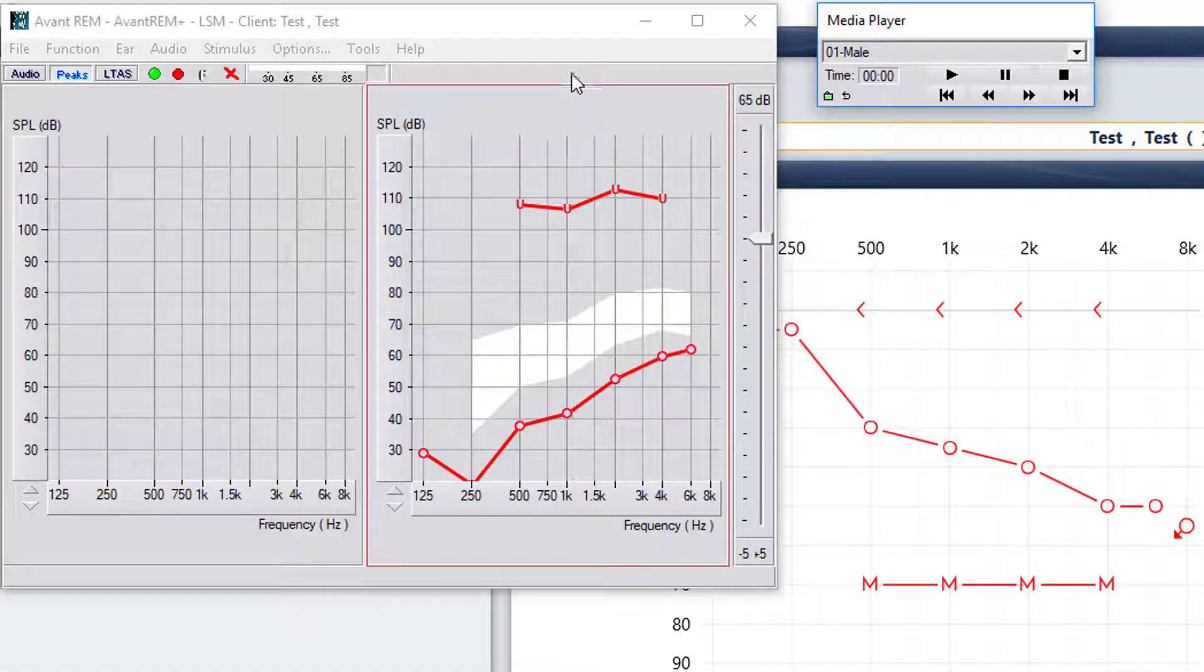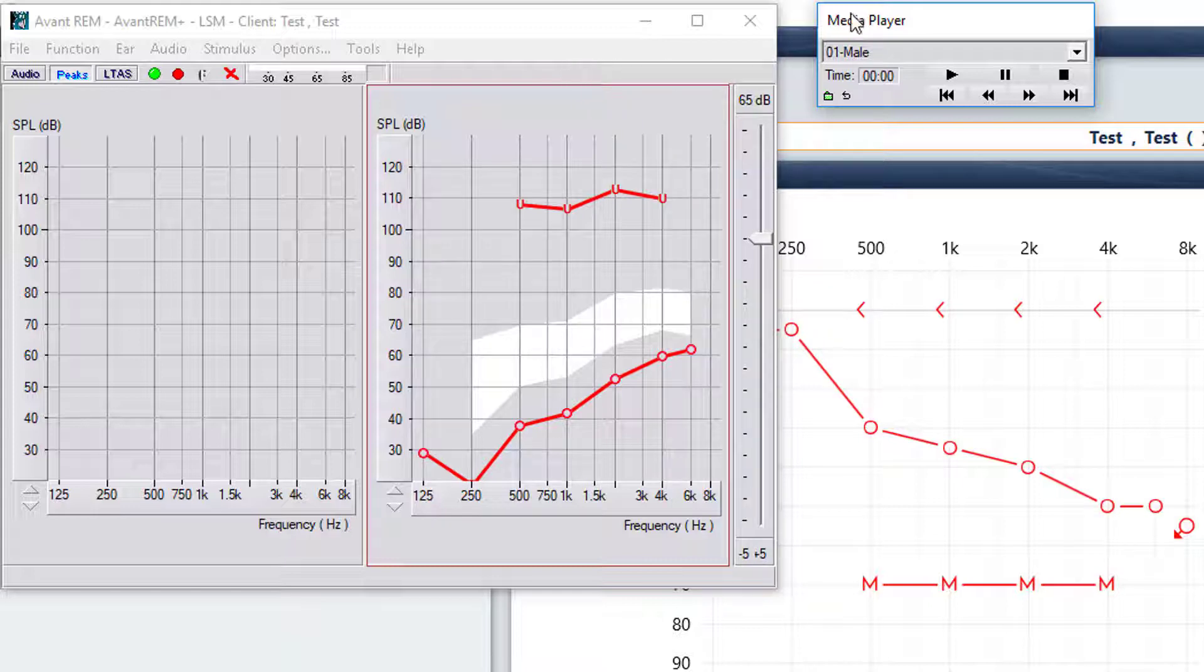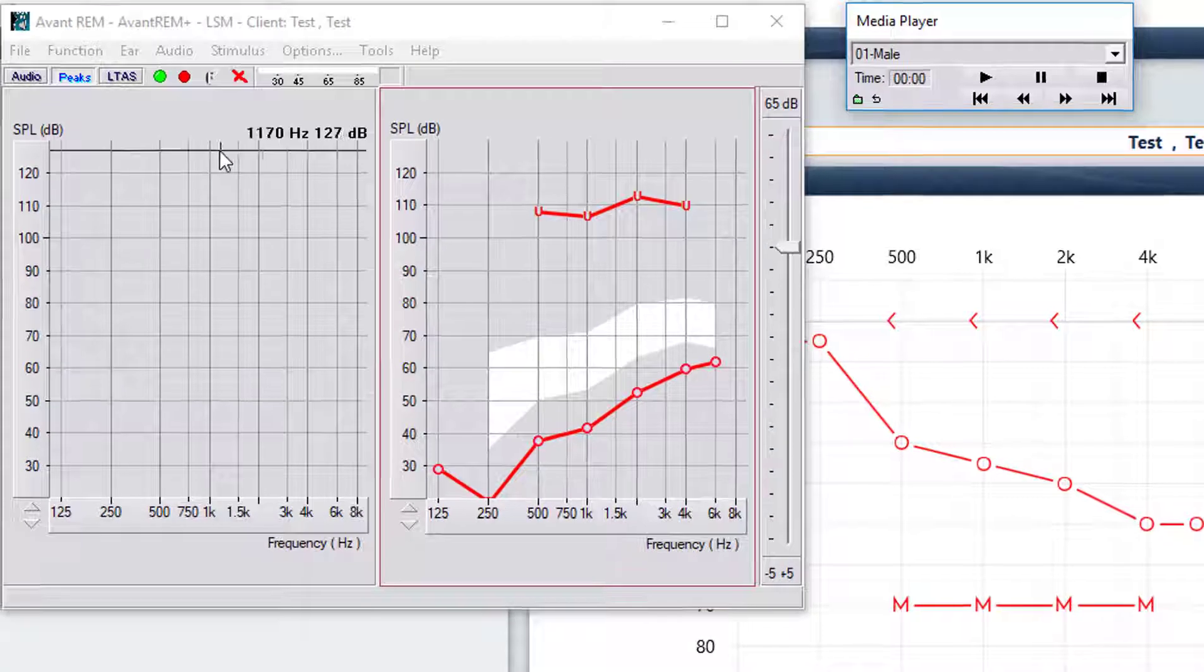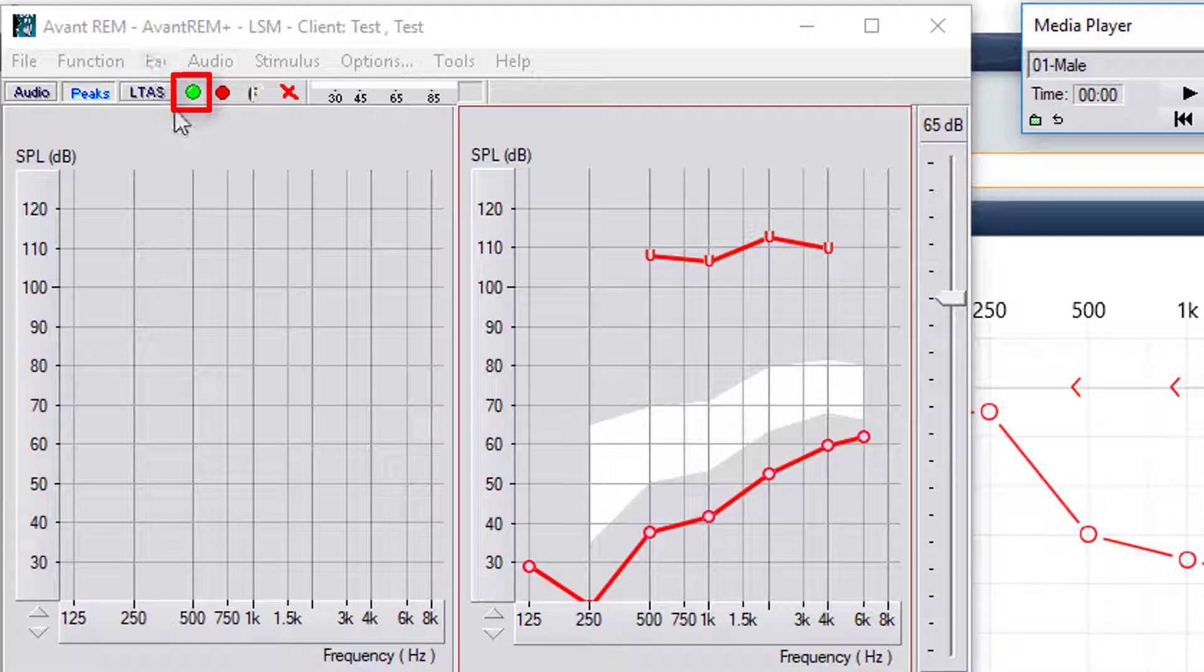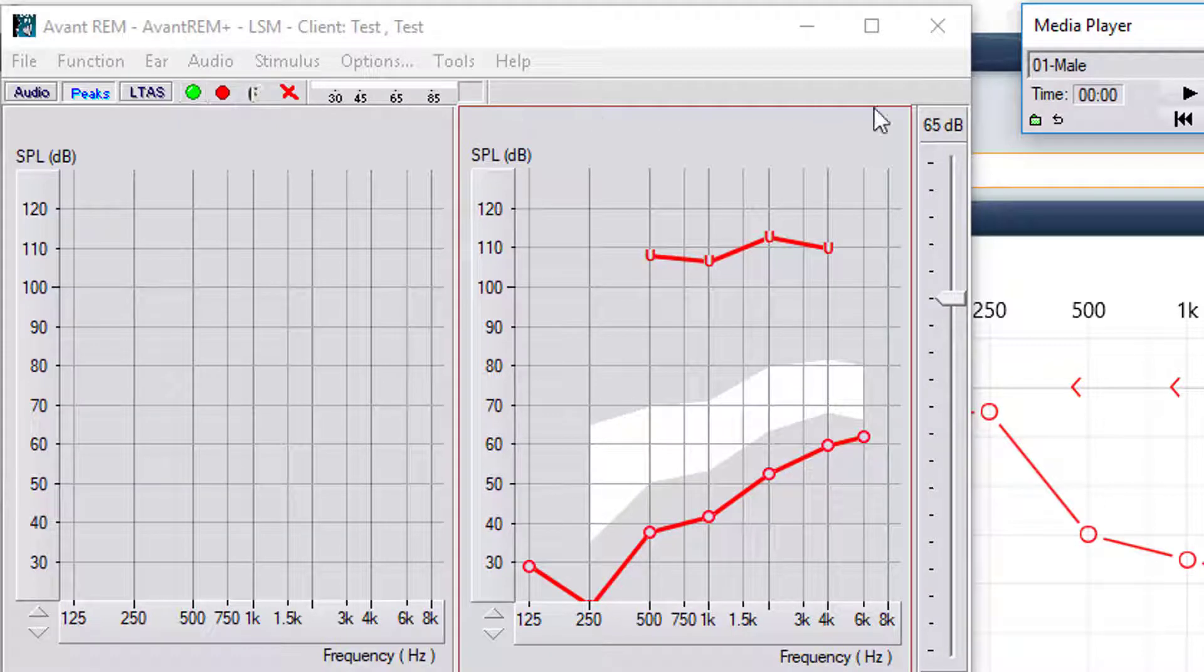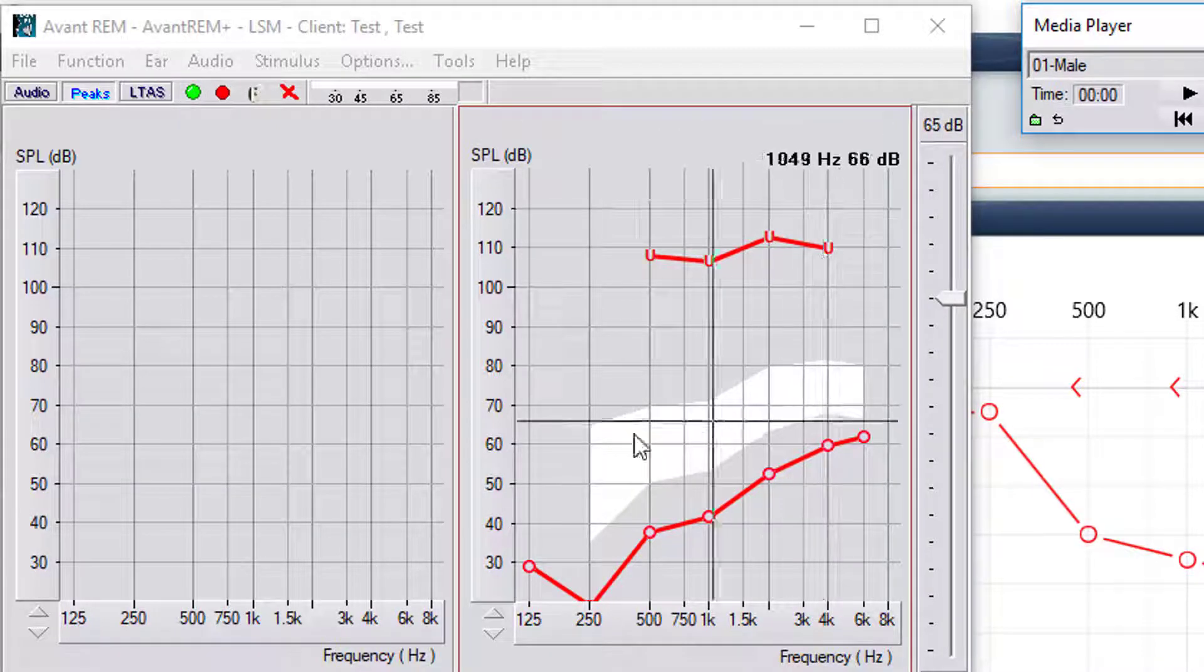So now that we have the probe tube in the ear, we have our file, we have our target, so we're going to go ahead and hit the green start button and it's going to calibrate to 65 and play the file at 65.